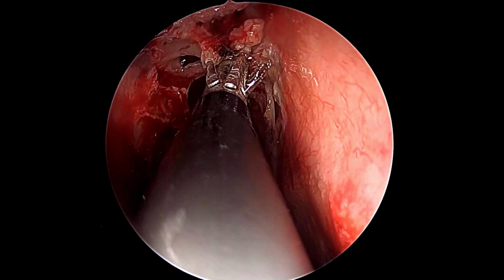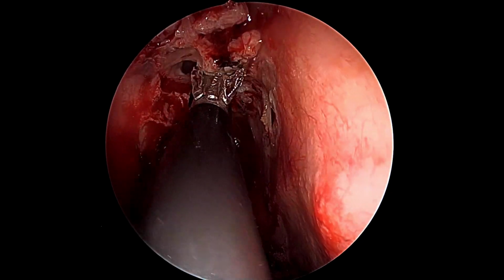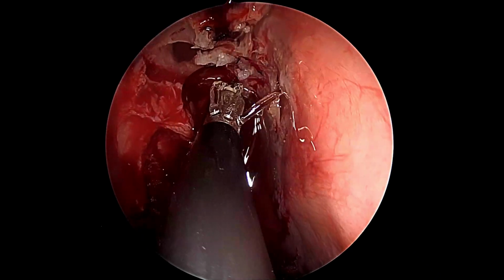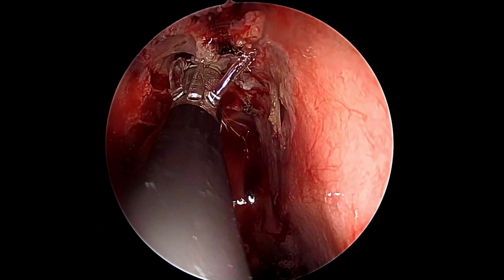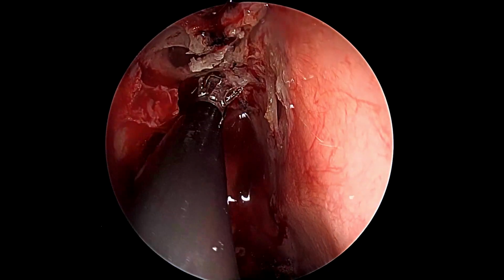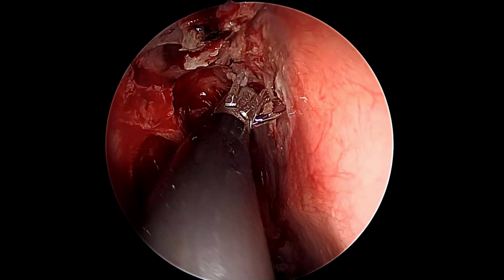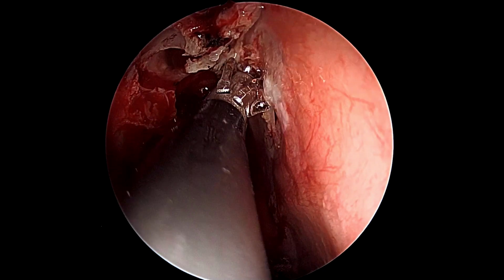Here we are using this wand on the coagulation mode, not the ablation mode. We do not want to ablate the meningocele. So we're using this on the coagulation mode just to achieve a lot of hemostasis as well as coagulate the mucosa on the meningocele and around it. This is the site of meningocele in front of us, but the wand was just in contact.